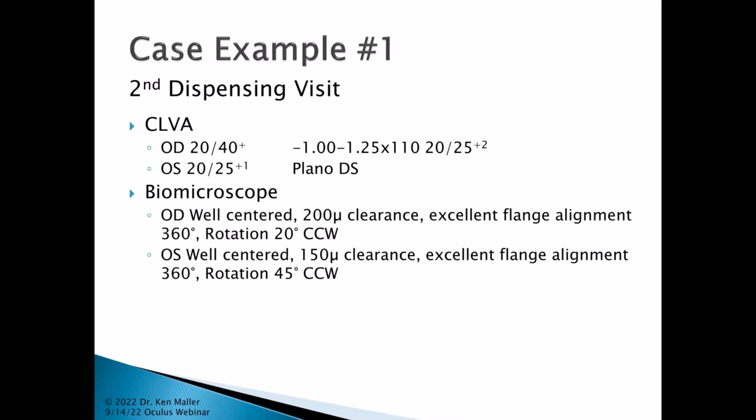As far as the fit goes, the right one was still fitting very, very nicely. 200 microns of clearance, excellent flange alignment, and the rotation was about the same, a couple of degrees further counterclockwise. But the left one, you can see here, although it was centered well, the clearance was good, and the flange was good, it had a strange rotation of 45 degrees counterclockwise.